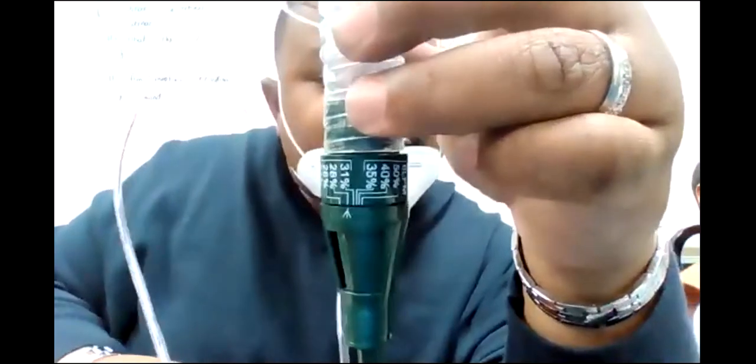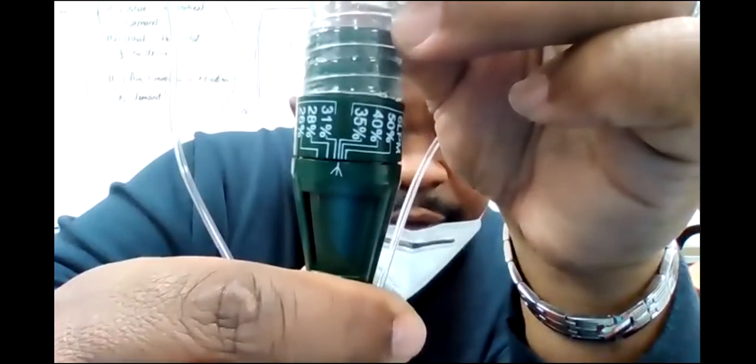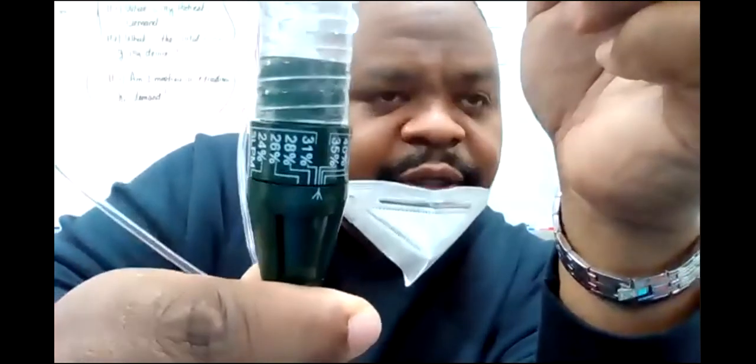So say they say, okay, I want you to put Mr. Johnson on a 40% Venturi mask. Well, I would simply come here, open this up, turn it to the 40, and it's about right there, right? Is that the 40? Yeah, that's all it takes. So you see the 40 goes down to about right there, something like that. And cut it on 6 liters, he's gonna be getting 40%.